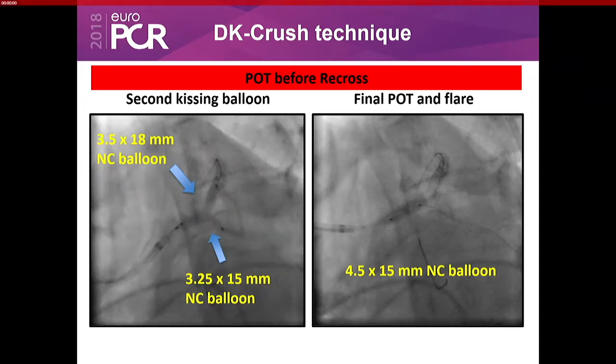So, practically speaking, we're talking about a very complex left main, and obviously there is a chance of error as well. So make it simple. I don't know, but I agree with you. I think there is no randomized trial that would make things much clearer. I think it's a matter of the angle. If you do have an acute angle, probably TAP is not the best option. That's my opinion.